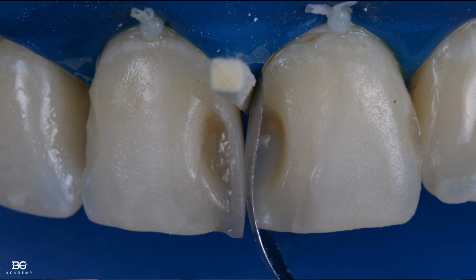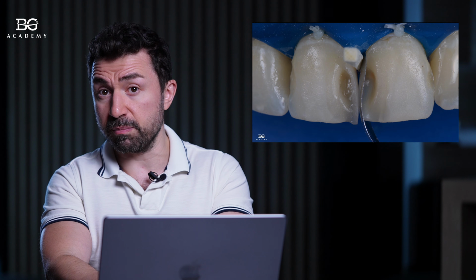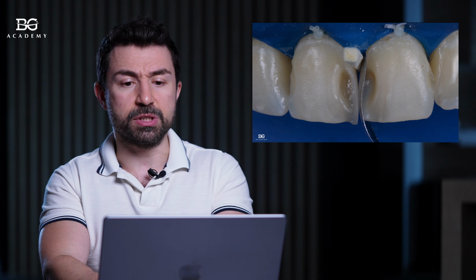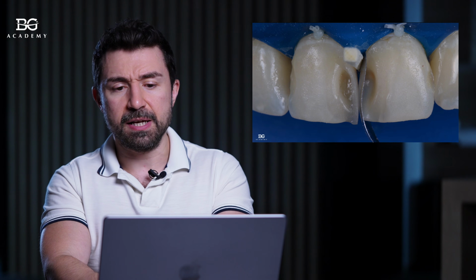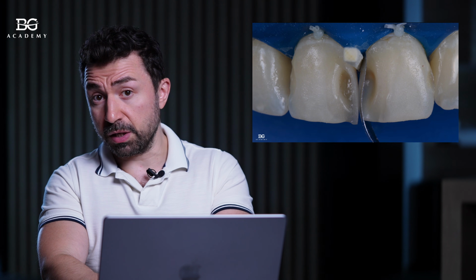So we are going to restore one, and you can see now here the contact point of the tooth 1.1 is restored. And I remove the matrix because if I keep two matrices at the same time, you will have not very tight interproximal contact. So you have to remove one matrix, and then you can change the wedge. In this case, I put a wooden wedge, that is stronger, let's say. And in this case, I would expect a very tight interproximal profile and contact point as well.